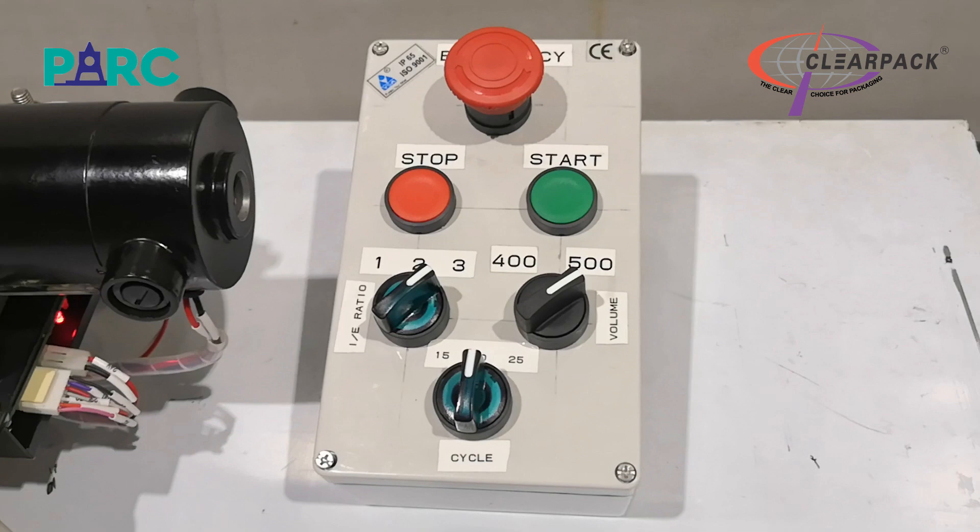Now let us look at the settings available on the operator pendant. In addition to the start and stop push buttons to operate the respiration cycle, there is also an emergency stop push button which immediately stops the respirator and activates an audible alarm.